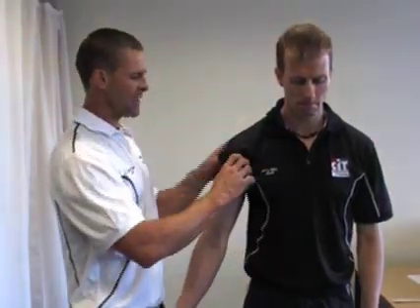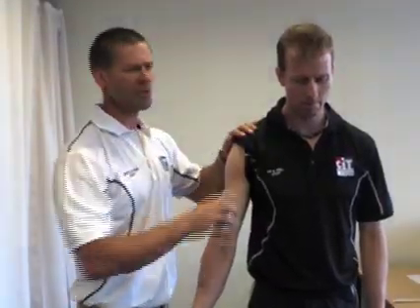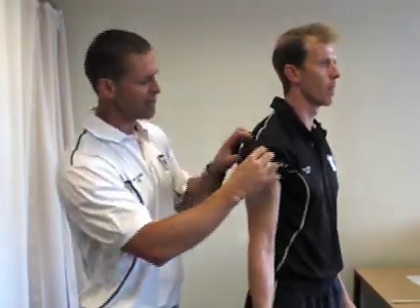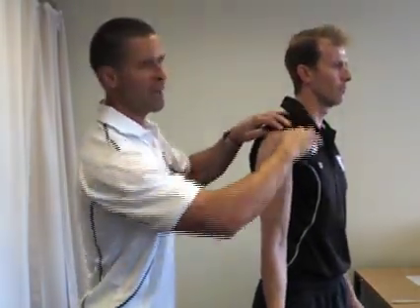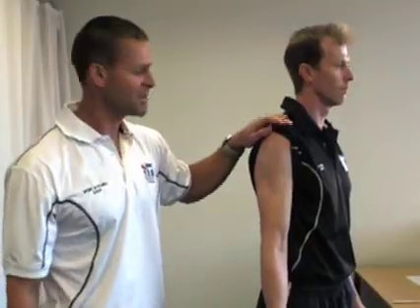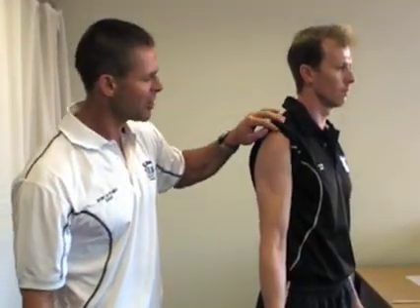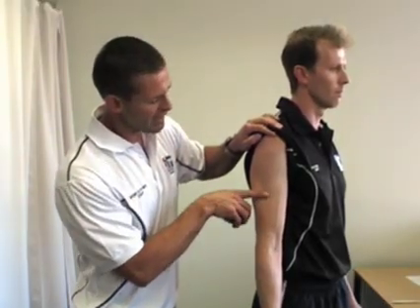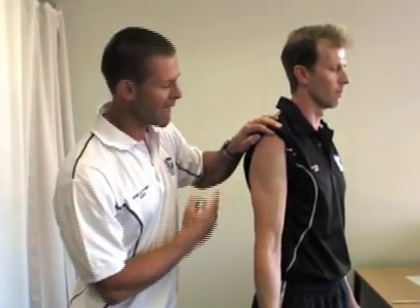Since we have a measurement from when we took Simon's girth measurements, we've got a midpoint. It's the same midpoint used when doing the upper arm girth measurement — we measure the difference between the acromion and the olecranon fossa at the bottom of the elbow, and this is the midpoint for the upper arm.